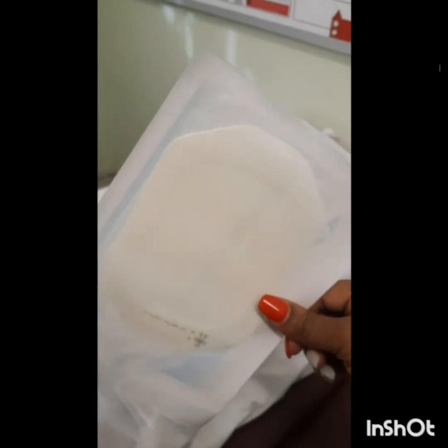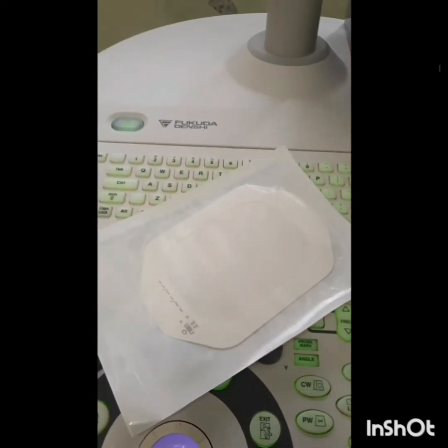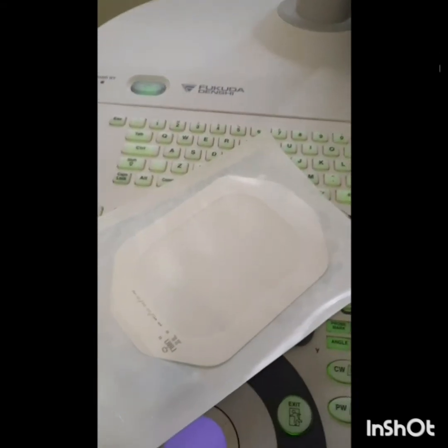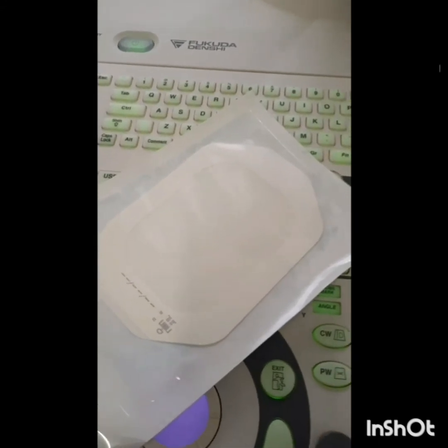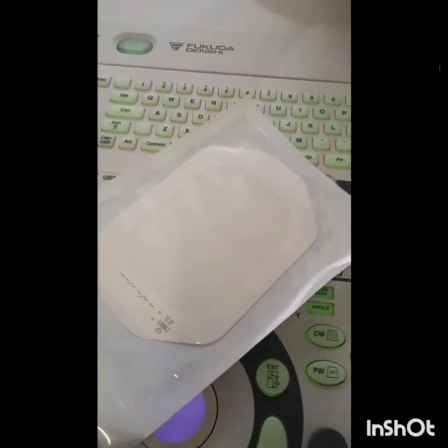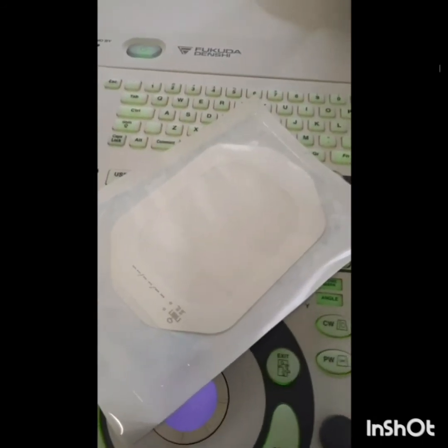The other thing is that you can use a Tegaderm, if your hospital has it. This is a clear adhesive film that you can put around the patient's eye. But when you use this, you must make sure that there's no entrapment of air below the Tegaderm, because that will make it difficult for you to properly scan the patient. As you know, air is not our friend in ultrasound unless you're doing lung ultrasound.